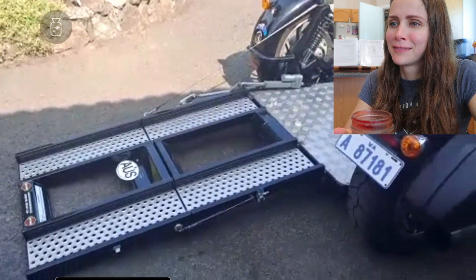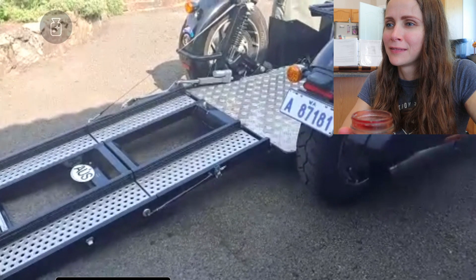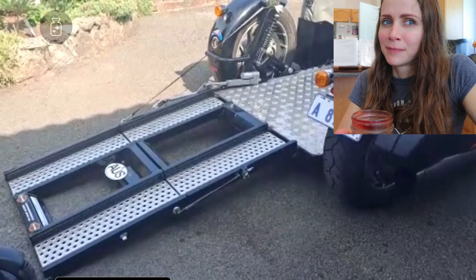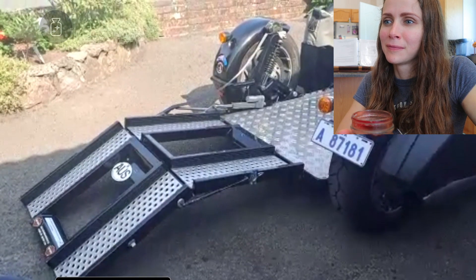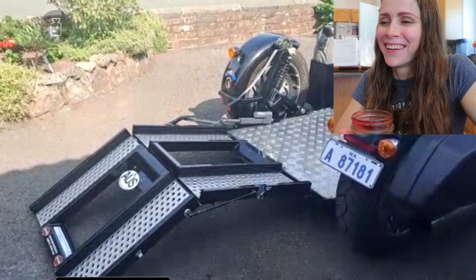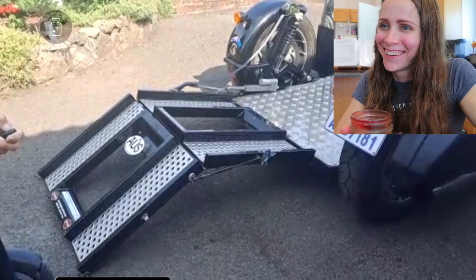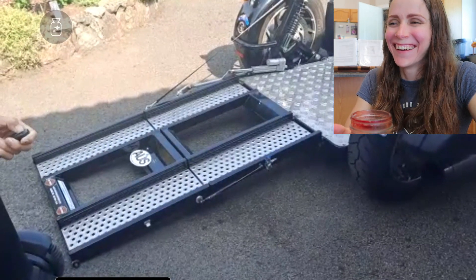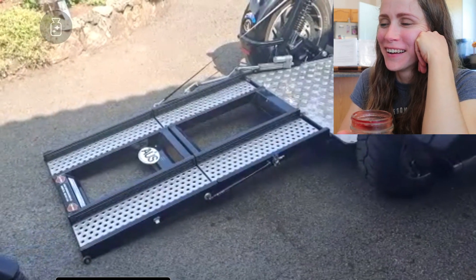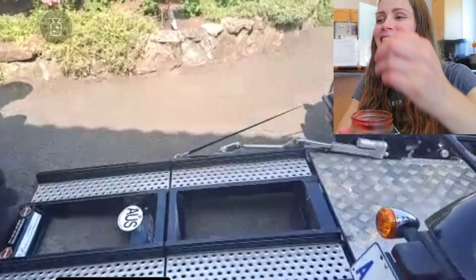This is the ramp that was made by Brendan, a really good friend of mine who has a place called BF Customs in Western Australia. We came up with this idea together. I'll show you — it folds up and then comes back down again. We made this ramp, drilled all these holes — he did all this work, it's unreal.